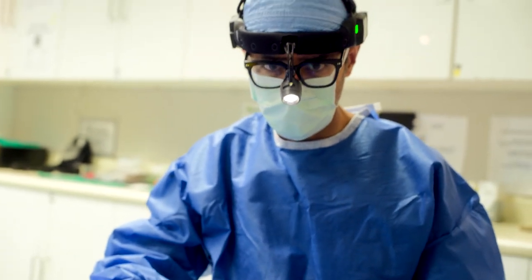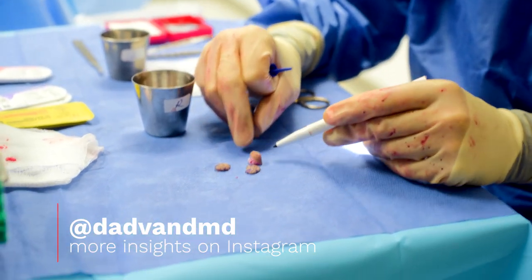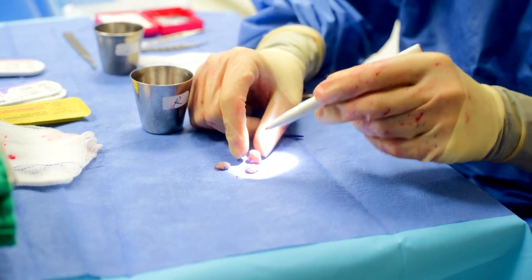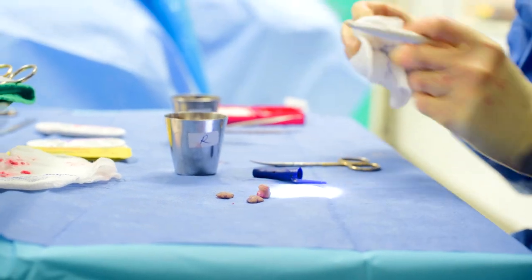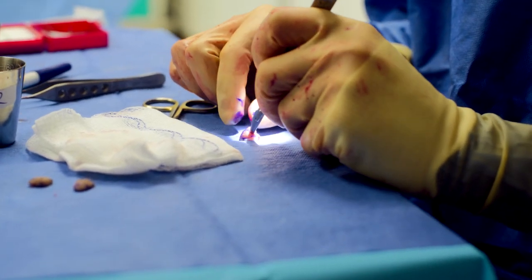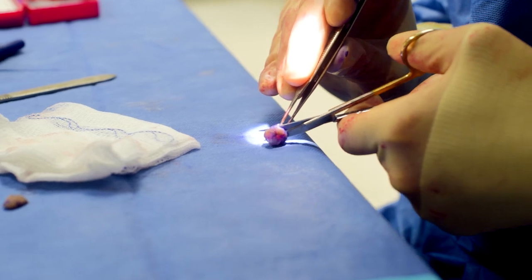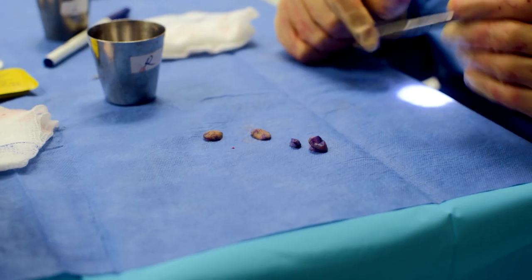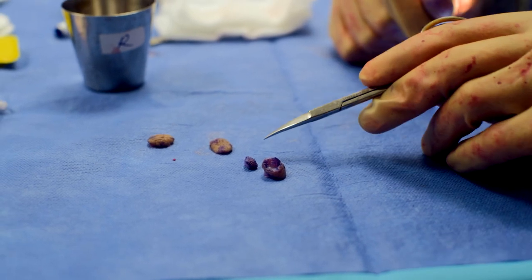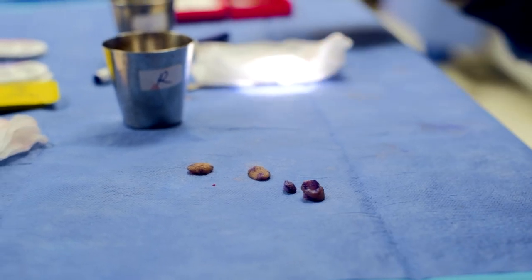This is the reason why I have to do a separate nipple graft. You can see this is his native nipple, and this is the size of the areola that he's going to finally have. Obviously this is way too big for an areola this size. So what I have to do is take a piece of this nipple so I can put it in the center and make it match his new smaller areola size. Here's the original nipple — I took a little piece of it right out of here. I'm going to make it a little bit smaller once I'm ready to sew it in. You can see this is going to match this areola much better than the whole thing. Now I'm just going to do the same thing with the other nipple.